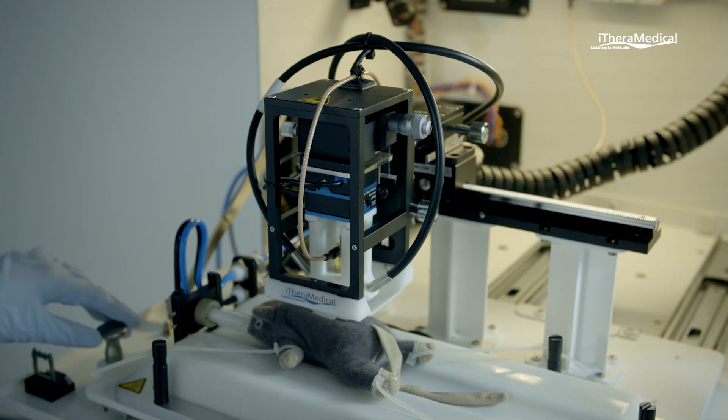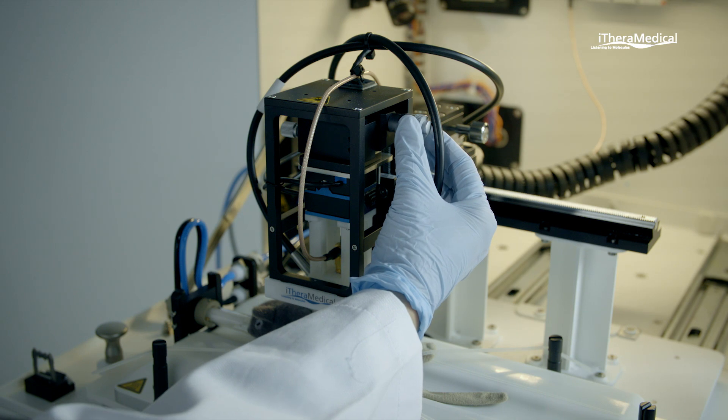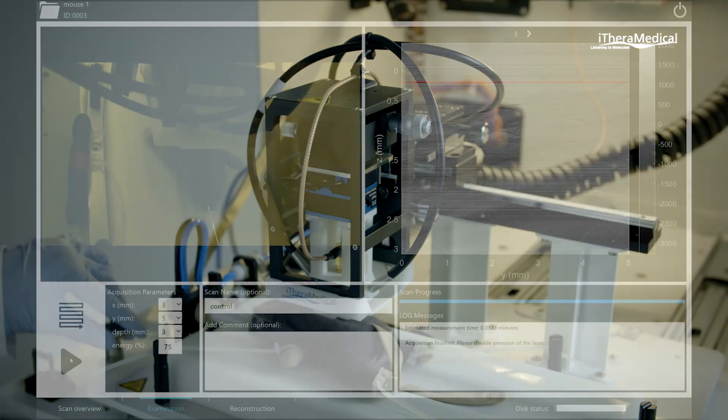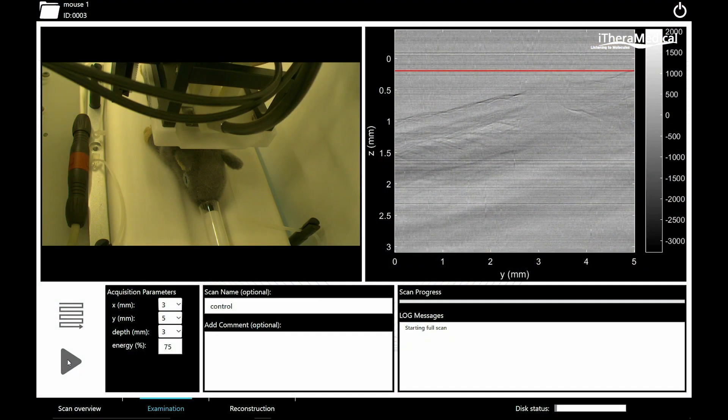The animal can be repositioned, or adjustment of the detector in the Z direction can be made. A full scan can be performed when the positioning is optimized.